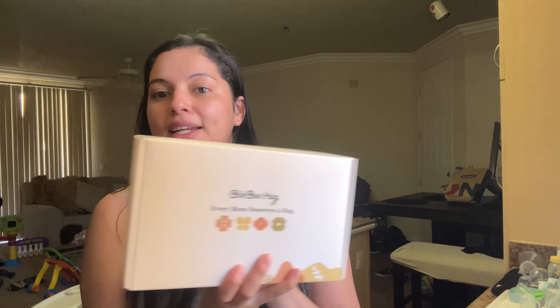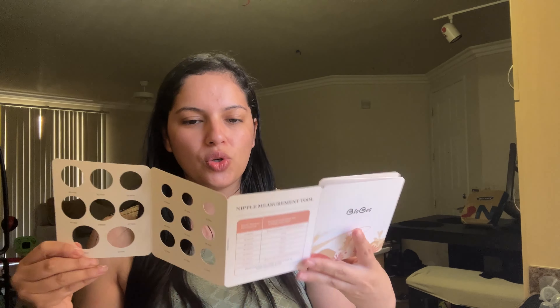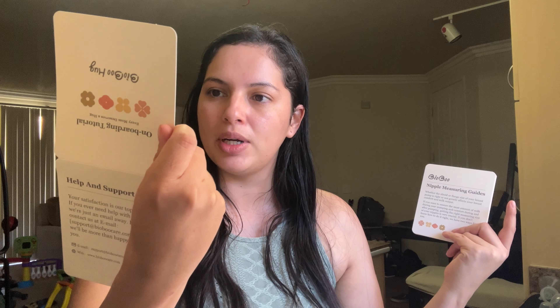I will pump using the BioBoo pump a little bit later and I'm going to give you guys my honest review. So let's go ahead and unbox together. What I think is pretty cool about this pump is you're able to measure your size already included, so you don't have to buy an extra nipple sizer — those cost like six dollars on Amazon. It comes with instructions showing how to insert it correctly and what the incorrect way looks like.